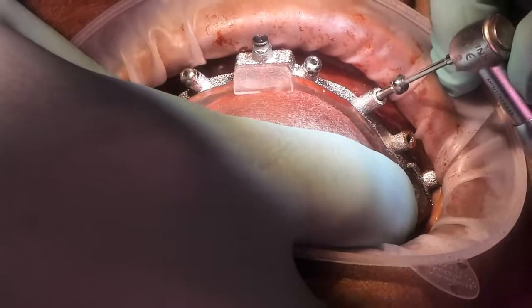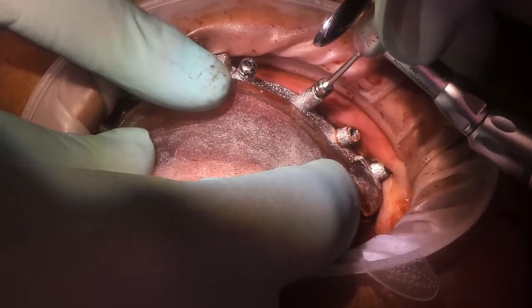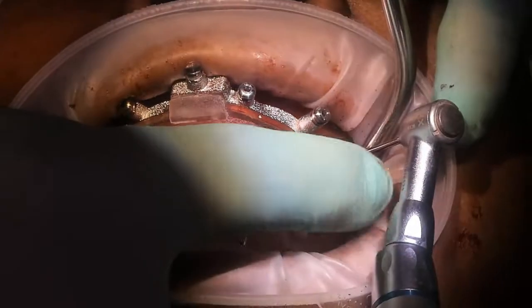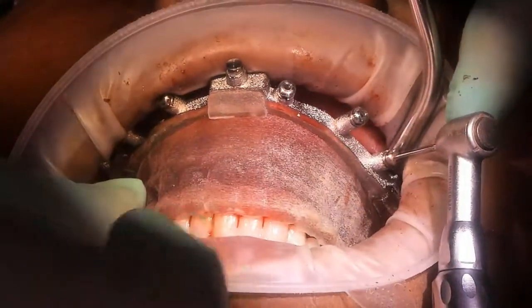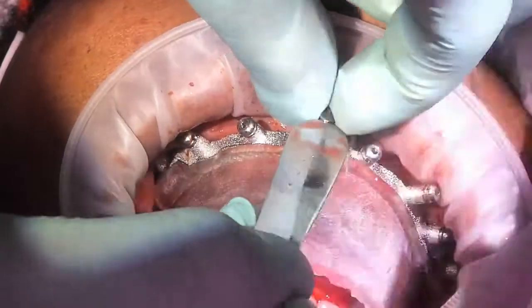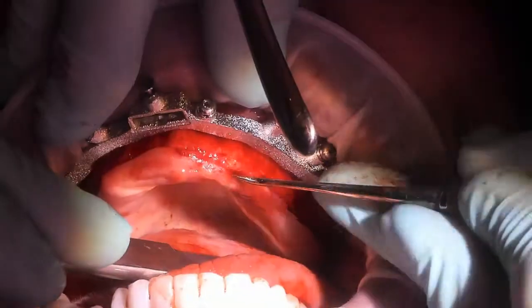We've heard issues over the years that if the sites are already drilled and then the fixation base is removed and the pin guide is removed, it could be difficult to find the holes again when inserting the fixation base later in the day when performing the other arch. However, the amount of accuracy that is included when you have both pin guides in is probably worth searching for the holes.